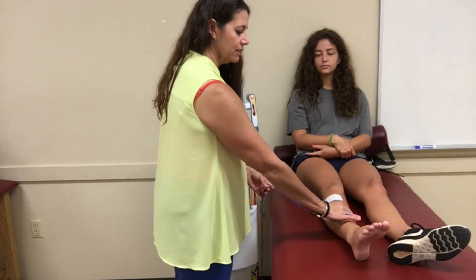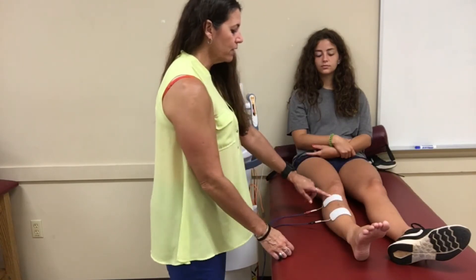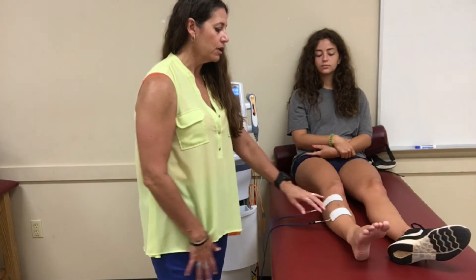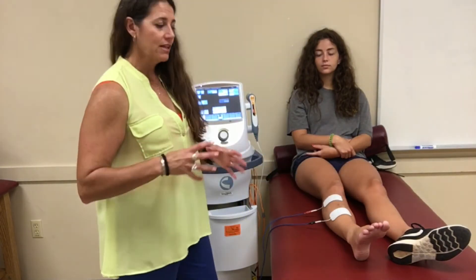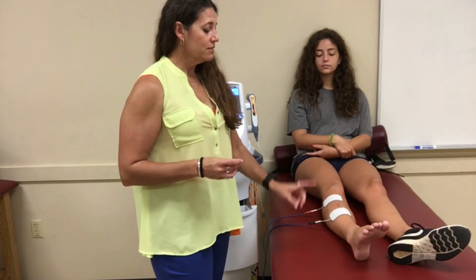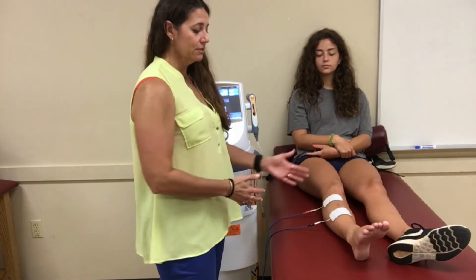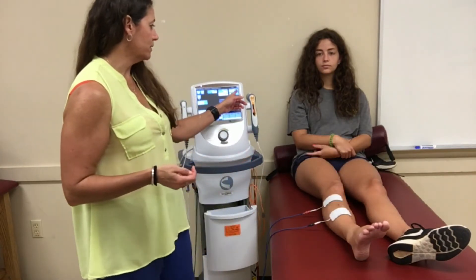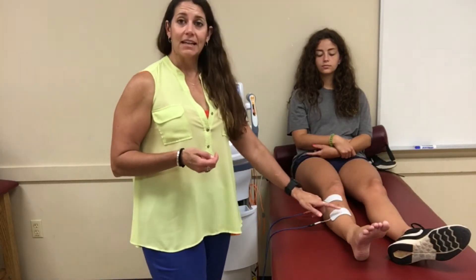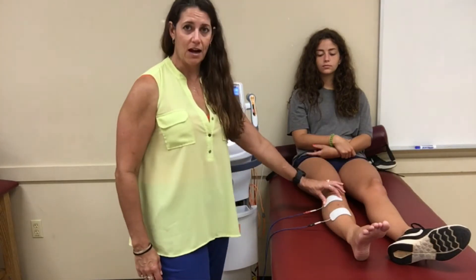Remember, it's best to start with negative polarity. Notice our negative lead is placed near — but not directly over — the wound, and it's going to pull current through to the positive lead. You need both electrodes around the area. Also keep in mind: if you're doing this for edema, you need to pay attention to which lead is positive or negative, because whichever lead you're focusing on — in this case negative — that electrode will want to be right over the most tender spot with the greatest edema.